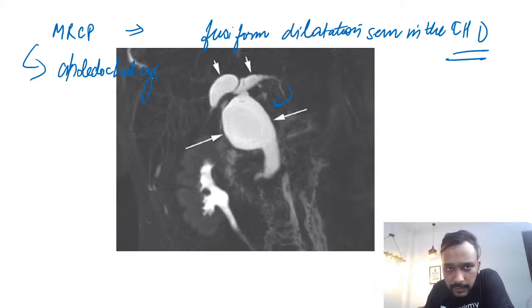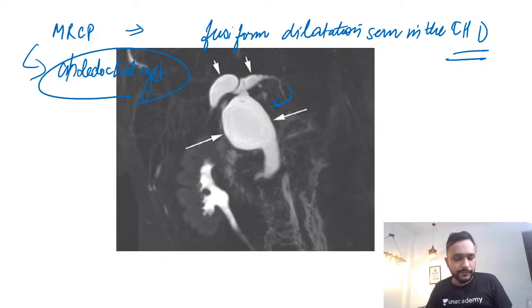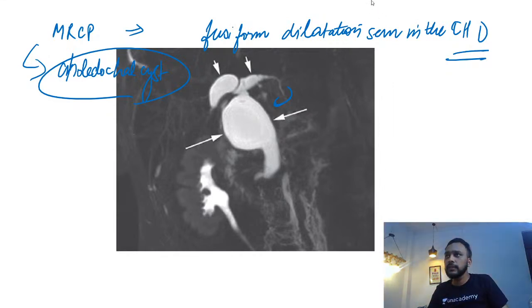Nimisha, just remember that in a case of double duct sign, let me show you the double duct sign as well, right? So just hold on.